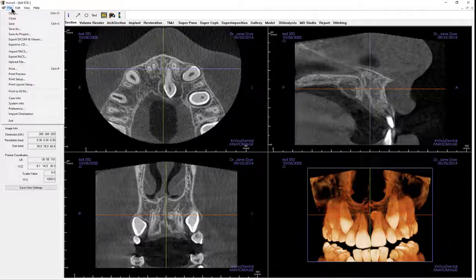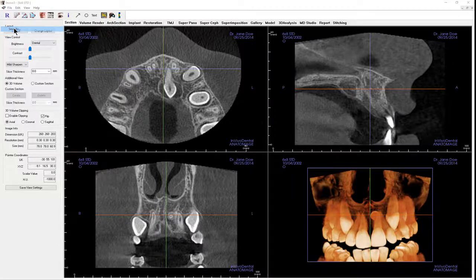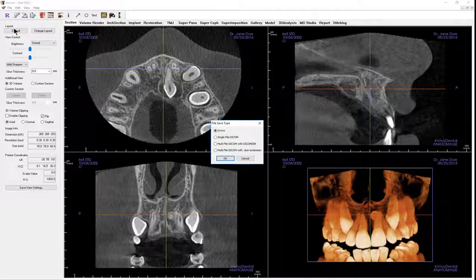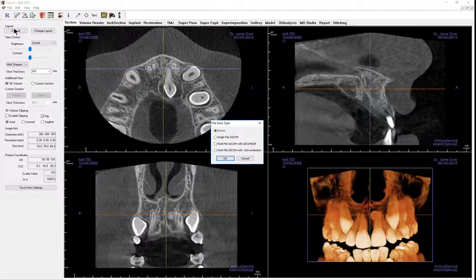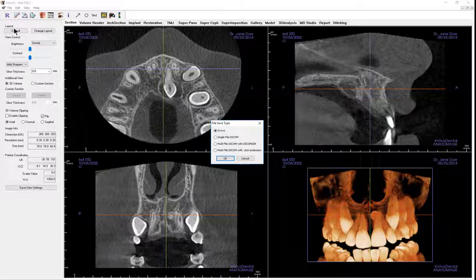In vivo offers three options when saving the original scan with any changes as a DICOM file: single file DICOM, multi-file DICOM with DICOM DIR, and multi-file DICOM with .dcm.